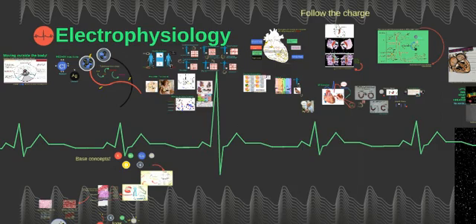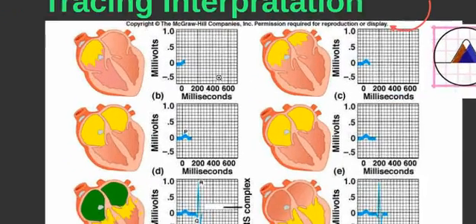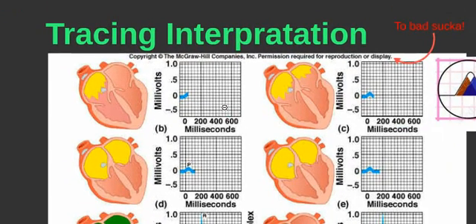All right, video number 5. Let's talk about EKG tracings. This is going to be a quick down and dirty of it real fast, and then we'll go into a little bit more in depth. But just to get our bearings straight, we're going to have this SA node firing in the atrium.